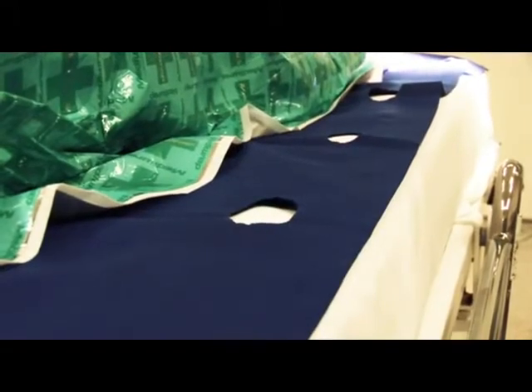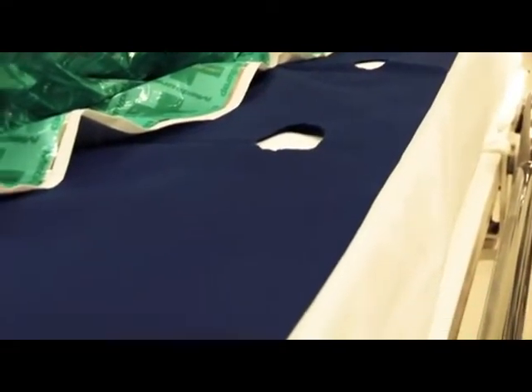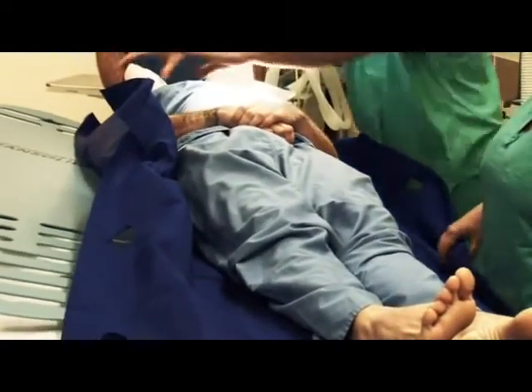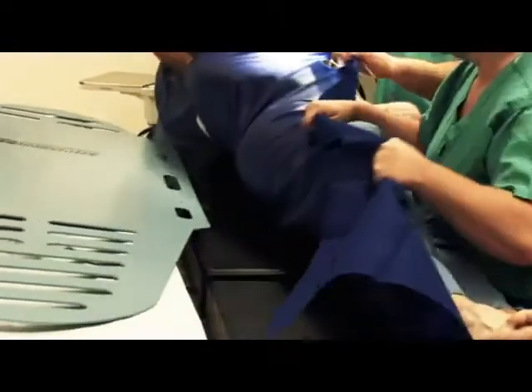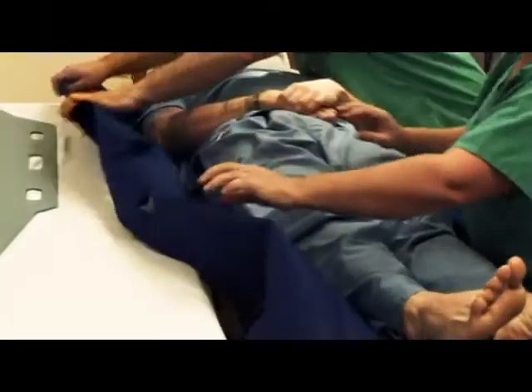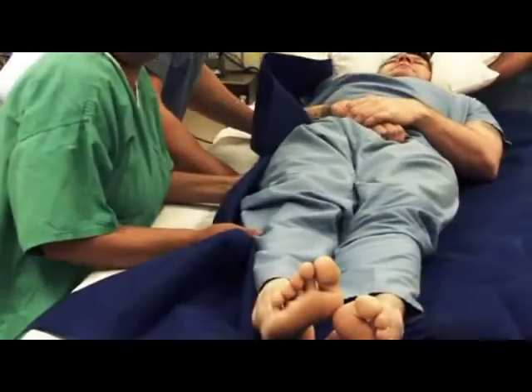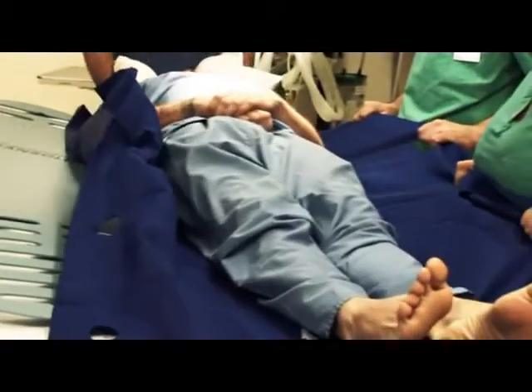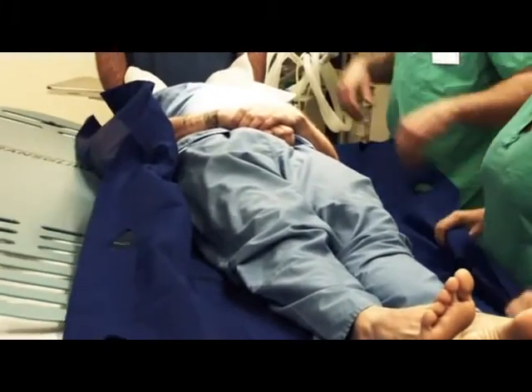There are five handholds either side of FlexiSlide, and you should use the ones which are most comfortable and appropriate to the patient. With a walk stance, Staff 1 and 2, with an anaesthetist, push the supine patient towards Staff 3 and 4. The staff should be positioned by the patient's hip and shoulder. With a walk stance, Staff 3 and 4, with an anaesthetist, pull the supine patient over to the receiving surface.